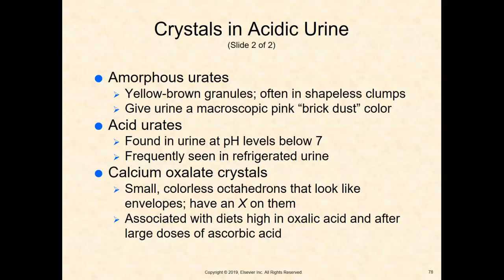So the second the patient goes to the bathroom, I want to get the urine in my hands within the next 10 minutes. If it sits for too long, the urine will actually start to turn kind of pink and look like somebody poured Pepto-Bismol in it. No joke. And this is normal. It doesn't mean there's something wrong with the patient whatsoever.